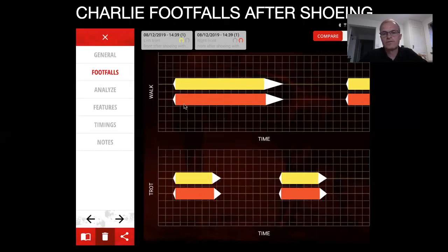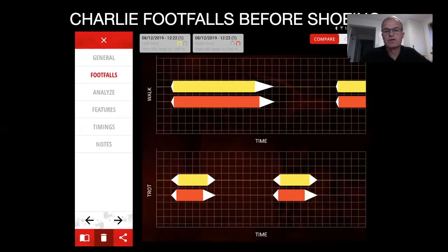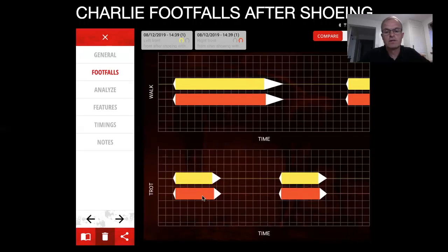So this is Charlie footfalls after shoeing. This is a comparison mode. You'll see in the top right hand corner we can compare or have a chronological order of stride. Each one of these squares represents 25 milliseconds, so it's in timing, not in distance. So landing, mid stance, breakover, and you could see Charlie's footfalls after shoeing. We had a lot more symmetry in stride in walk and trot. So that's before shoeing and then after shoeing. I was quite happy with this result.